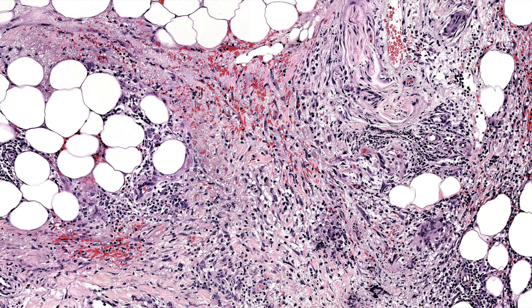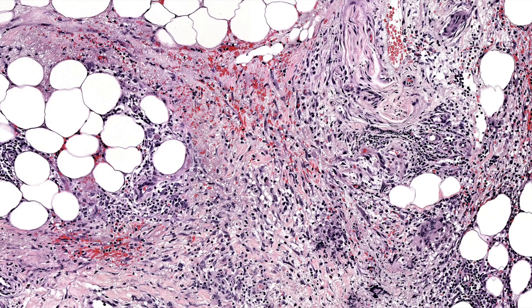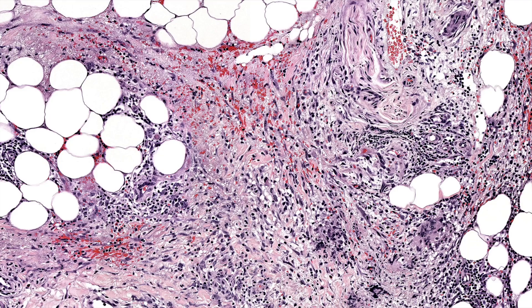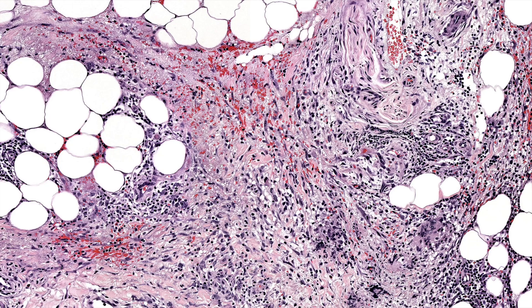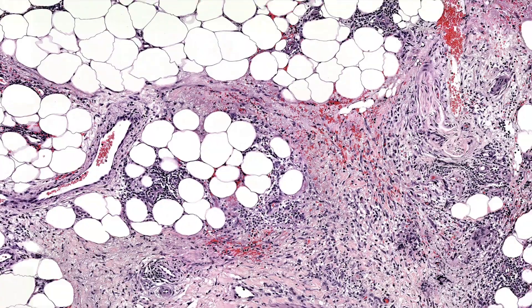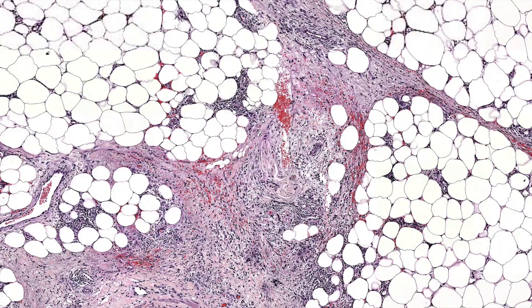Think about ANCA vasculitis and other things if you're starting to see a lot of vascular damage. But if it otherwise fits well for erythema nodosum clinically and you just see a little vascular damage microscopically, that's still totally fine for erythema nodosum. Start thinking about other things if you see a lot of neutrophils and a lot of vascular damage. But this is a really great example of erythema nodosum.